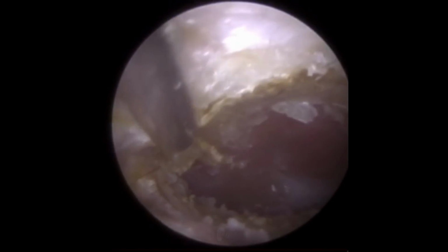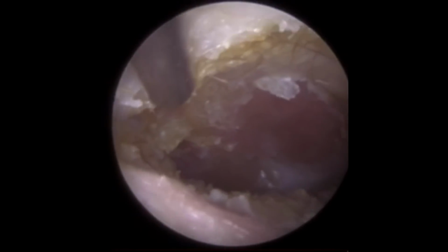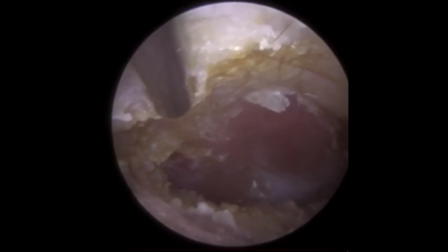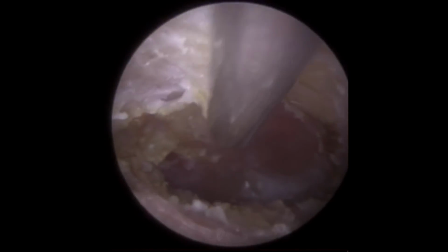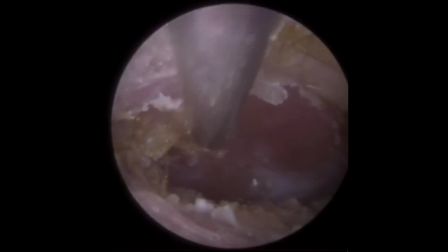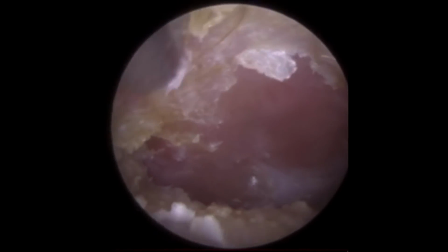Also, with a healthy eardrum, you tend to get what we call a light reflex. So when you examine the ear, obviously you're introducing some sort of light source to illuminate the ear canal, otherwise it's very dark in there. And with a healthy eardrum, you get a reflection of light back from that light source, whether it's an otoscope or an endoscope, which is what we're using for this procedure. And this eardrum is very dull. There's no light reflex coming back. And you can just see it's very red and very inflamed.